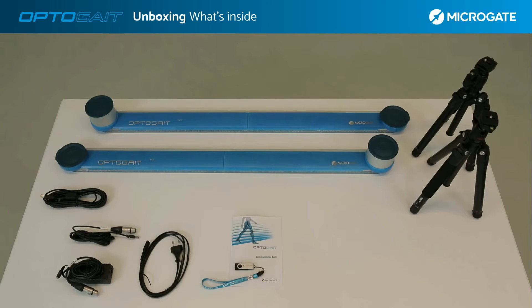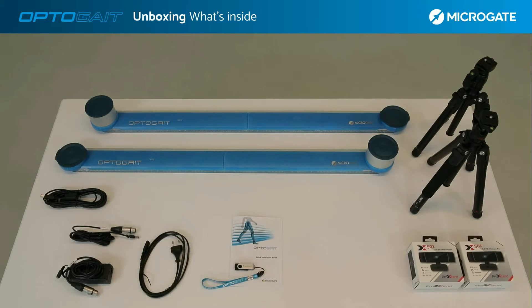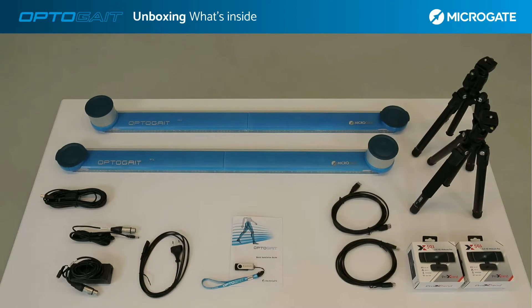Two tripods, ranging from 42 centimeters up to 125 centimeters, allow the installation of the webcam or any device up to a maximum weight of 8 kilograms. The kit includes two 30-frames-per-second webcams in the basic configuration, with dedicated USB cables for connecting both webcams to the computer. If needed, you can also install 90-frames-per-second webcams for more detailed video analysis.